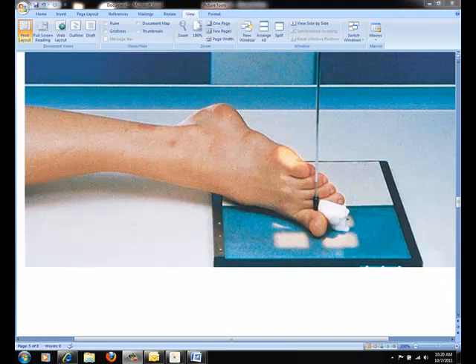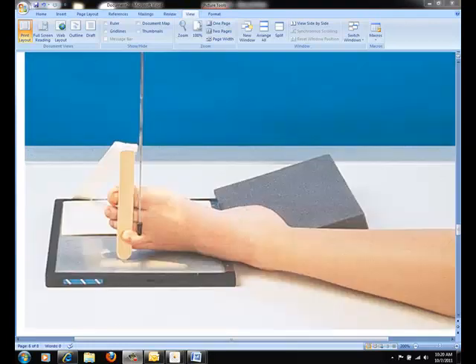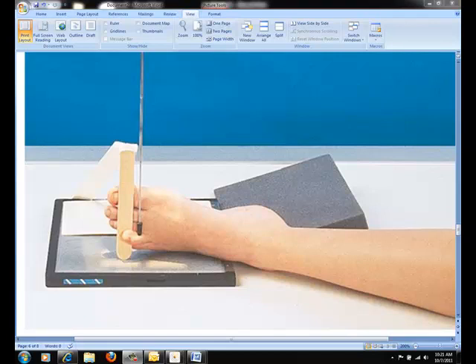Here is an example of the great toe being the toe of interest. And here is an example of the fourth digit, the main toe of interest. Notice that sometimes you have to get creative to get the toe separated from the rest of the toes, so no superimposition is available or present.